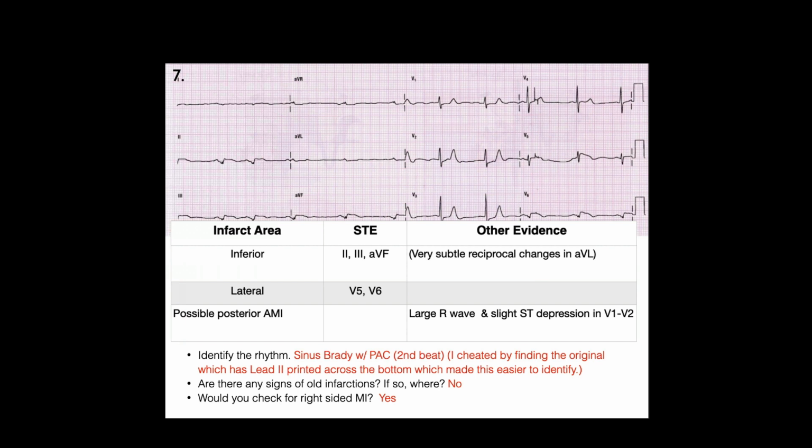There's another one, and I can't remember if it's in here or in the extra STEMI homework, that's a 3rd degree AV block, which was almost impossible to figure out. So that's my reasoning for asking you to do it. If you can't do it, it's really because it's hard and kind of silly, because you need more than 2.5 seconds. Okay?